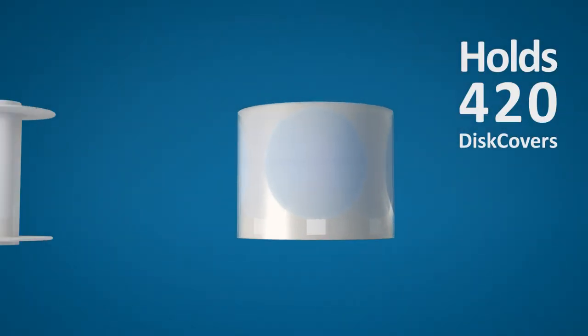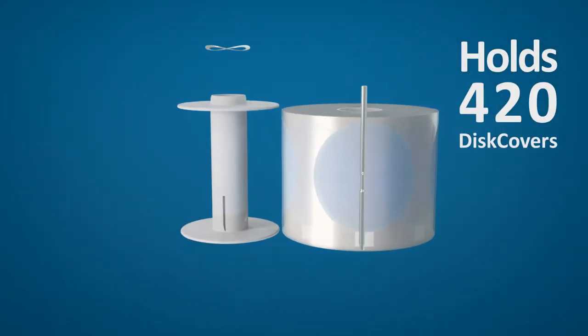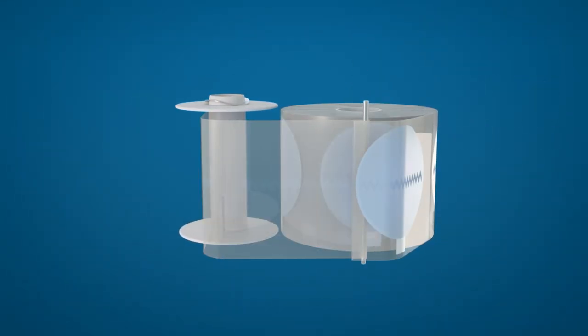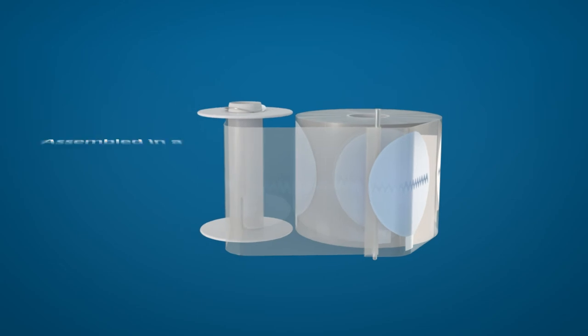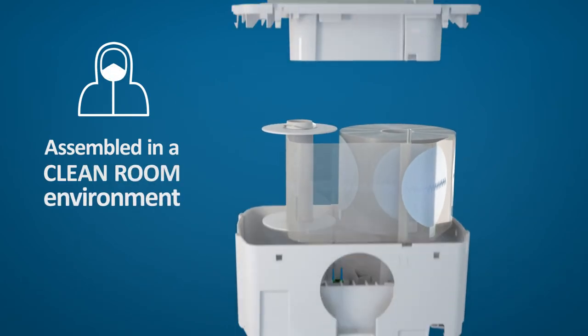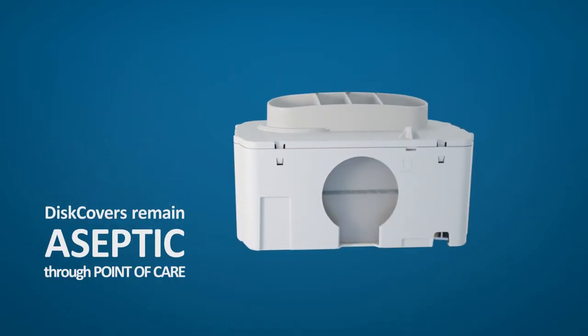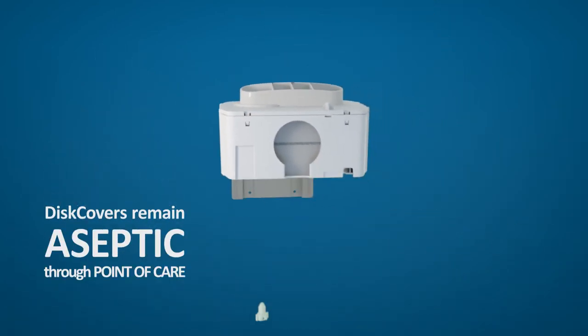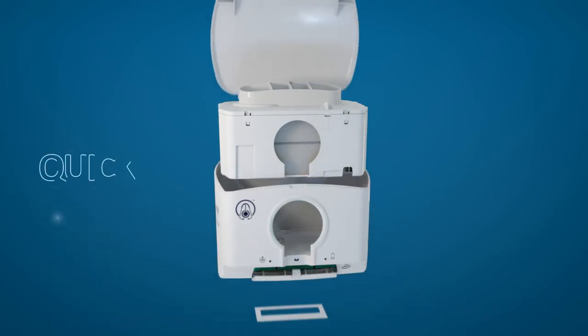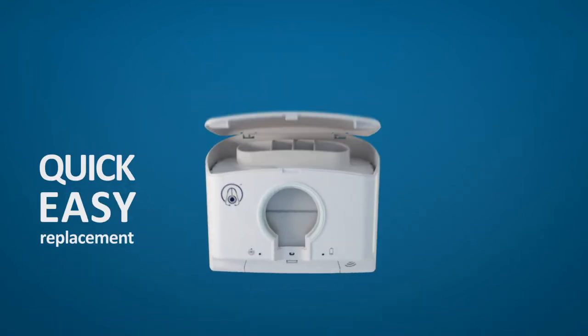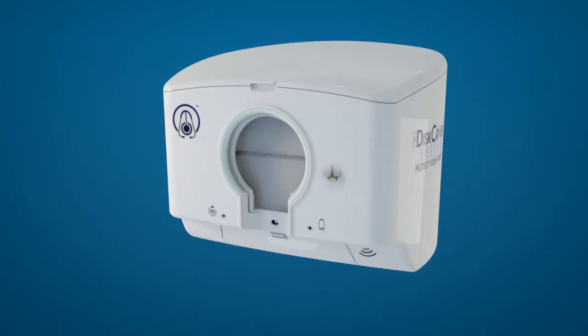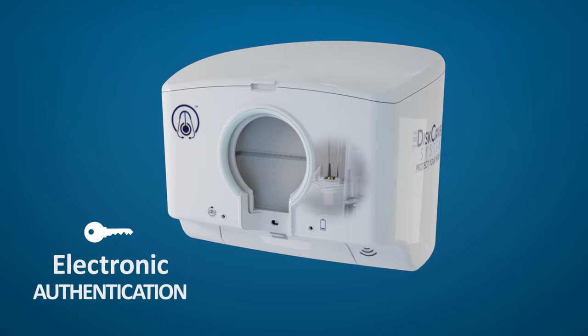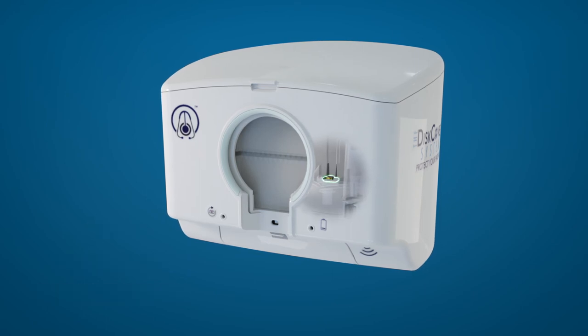420 single-use DISCOVERs are housed inside every clean cassette, which are assembled in a clean room environment. Each DISCOVER remains aseptic through the point of care. Clean cassettes offer quick and easy replacement, and are designed to work exclusively with the DISCOVER system dispenser.